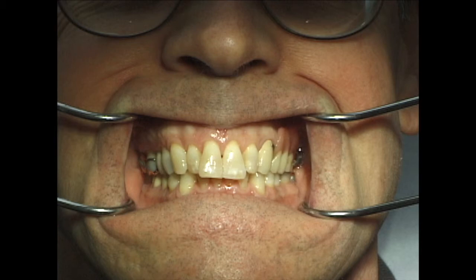I'll give you a hint. All of the muscles below the mandible are quiet. There is no contraction of the supra or infrahyoid musculature. We made a clutch for him which allowed us to attach a face bow to the lower teeth without covering the occlusal surfaces, located the hinge axis, and watched the exact pattern of movement with a face bow. It is straight up and down, not along the protrusive pathway of the eminence.